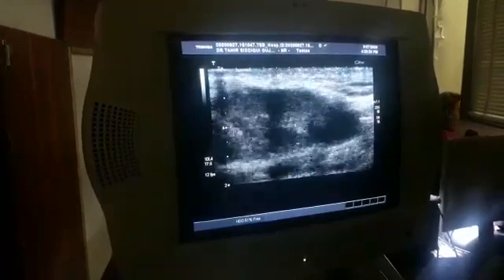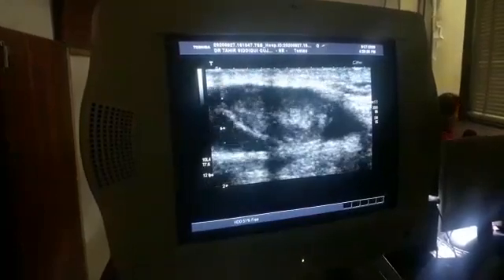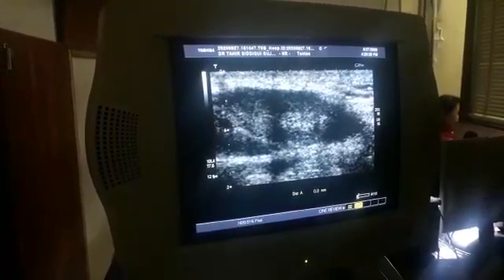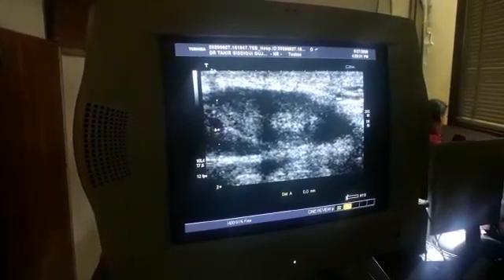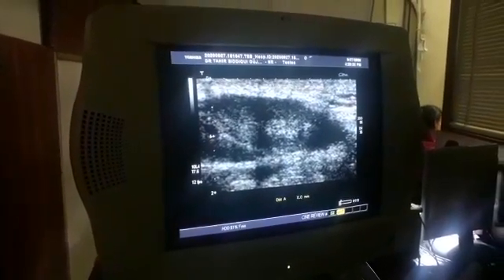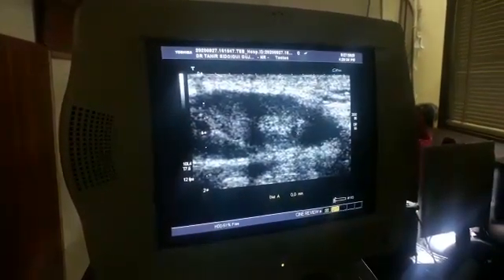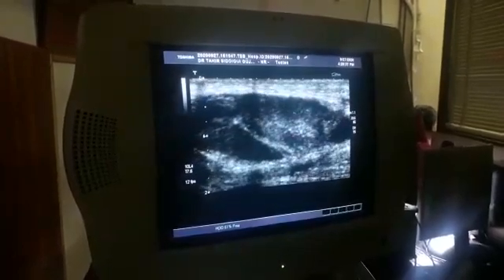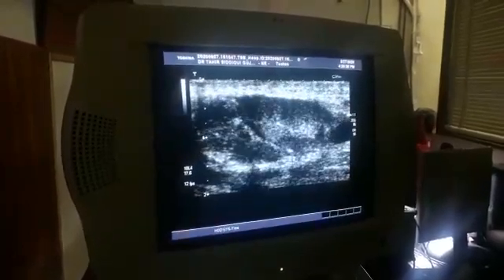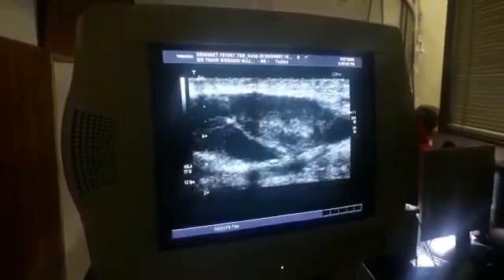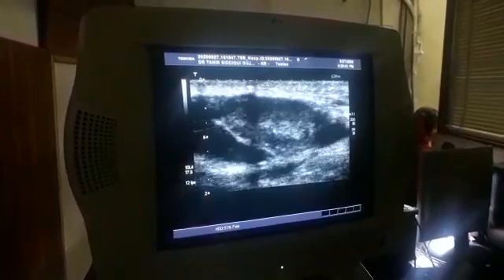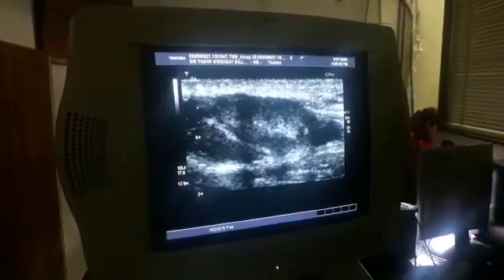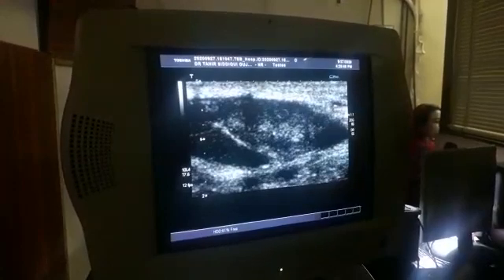The central region is in fact suggestive of the mediastinum testis. The central echogenic band here appears thick because I have magnified it, and I am scanning with a 7 megahertz linear probe — high frequency, superficial.